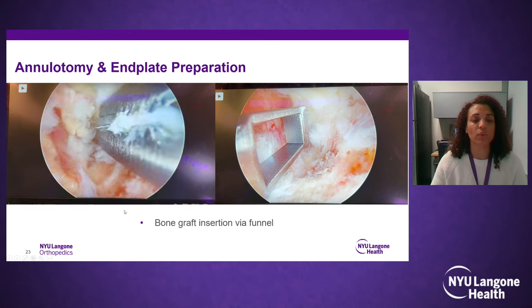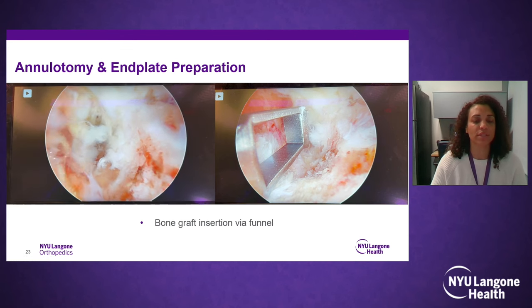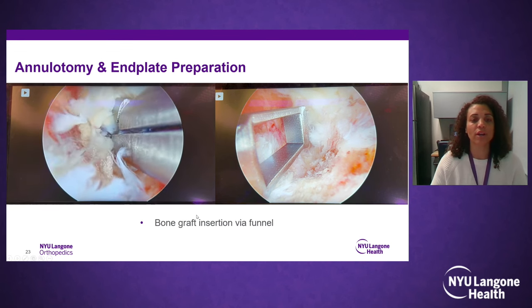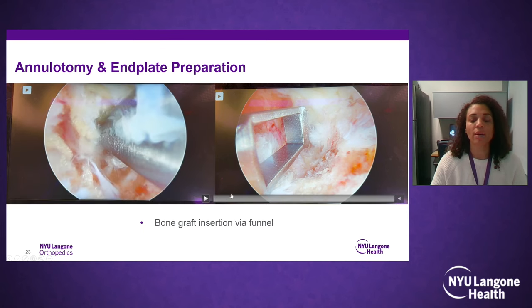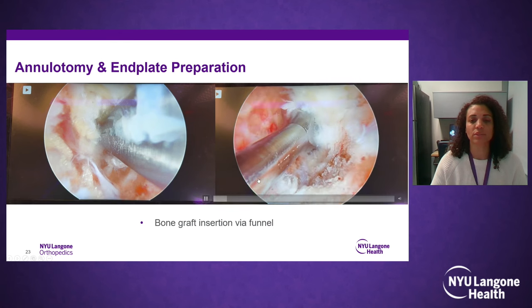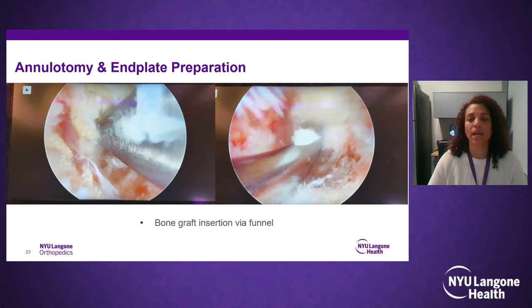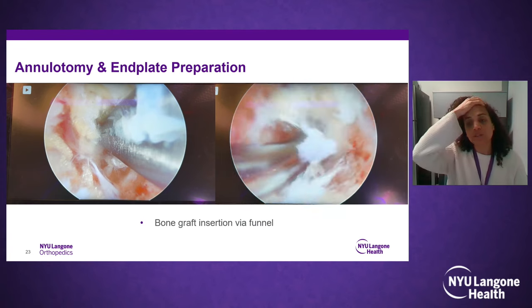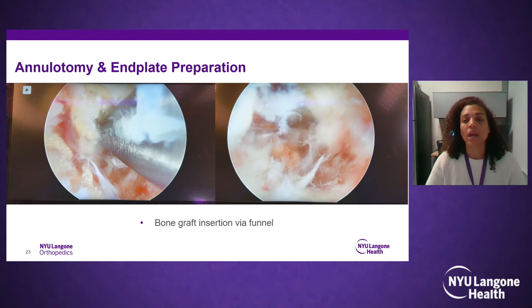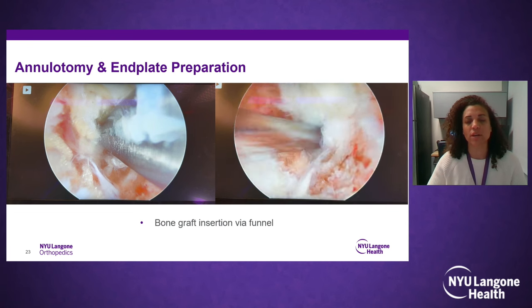The same way you would with any TLIF, you want to clear out all the disc. There are different tools that are specialized to the biportal technique. You can use different curettes and different end plate curettes, and you can really get a good feel. Depending on the quality of the bone, you don't want to go too crazy on this part because you don't want to violate the end plate, right? But you can get a sense, and you can really feel.